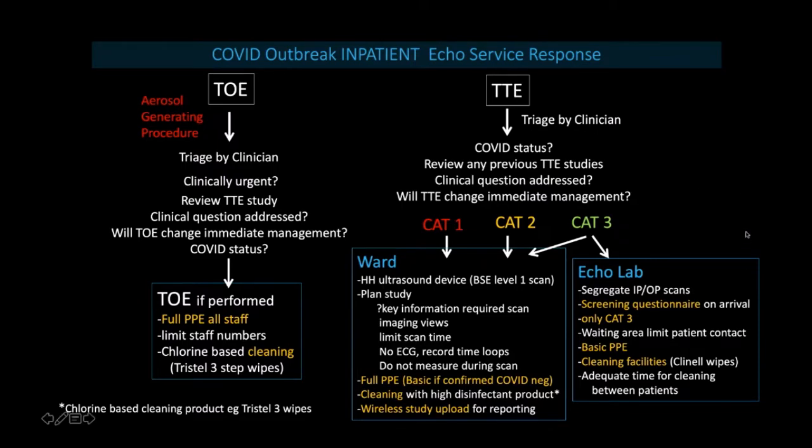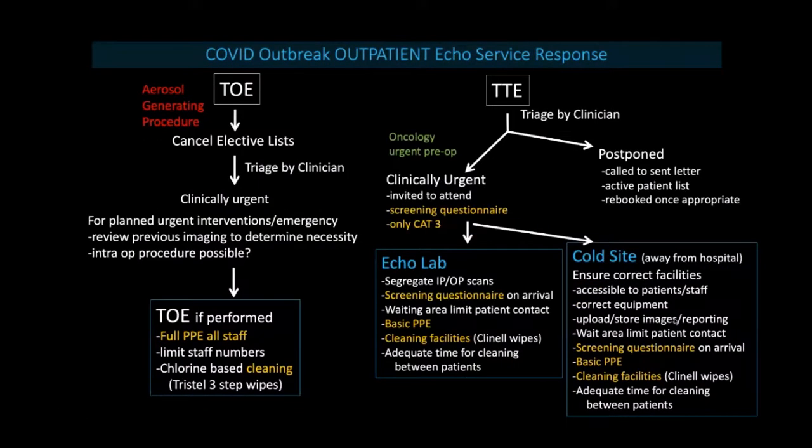And then category 3, those patients that are clean, they can go to our clean echo lab, which we're keeping clean throughout. And the issue that I would highlight here is this concept of segregating inpatient and outpatient scans within the lab, so you clearly keep everything as clean and as green as possible.